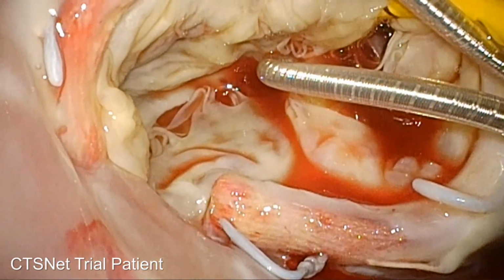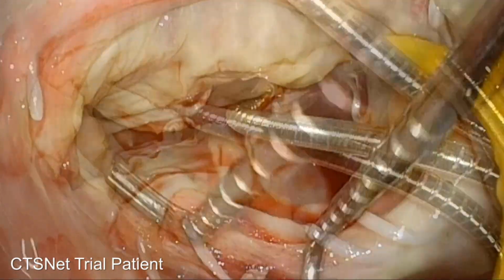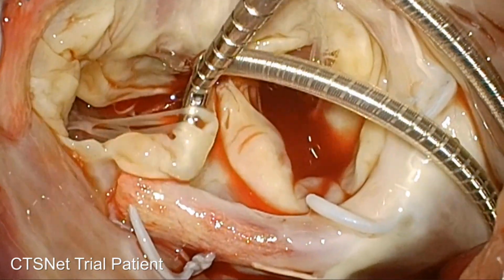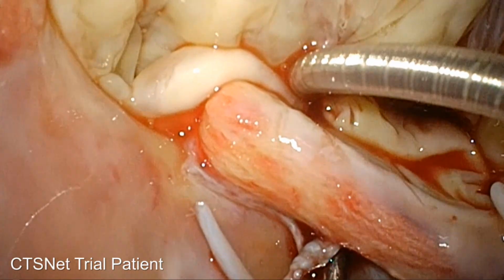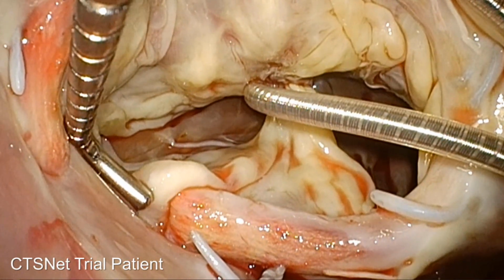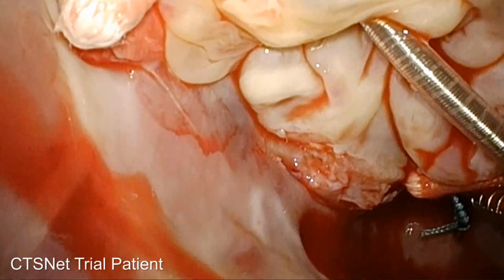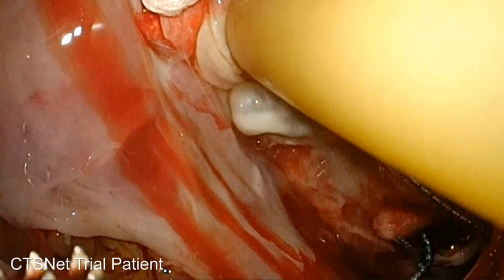This is what you should never do. You see the surgeon already, this is a redo case, almost put the ring across the AV node. Of course, the patient needed a pacemaker. So you're doing a tricuspid repair to prevent or to fix tricuspid regurgitation. Then you give the patient a complete heart block with transvenous pacing, which will bring back this tricuspid regurgitation. And then you inherit all the complications of permanent pacing. We redid the tricuspid annuloplasty, and you can see that gap, the difference between the Triad and the original ring.